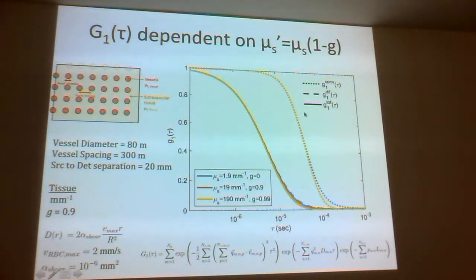So that's kind of point number one, right? That this now explains why Igor and I first saw in 1995 that we had to fit the data with Brownian motion rather than with linear motion.